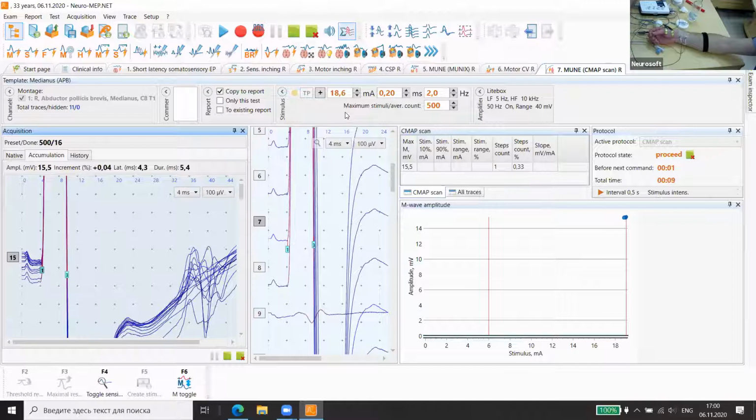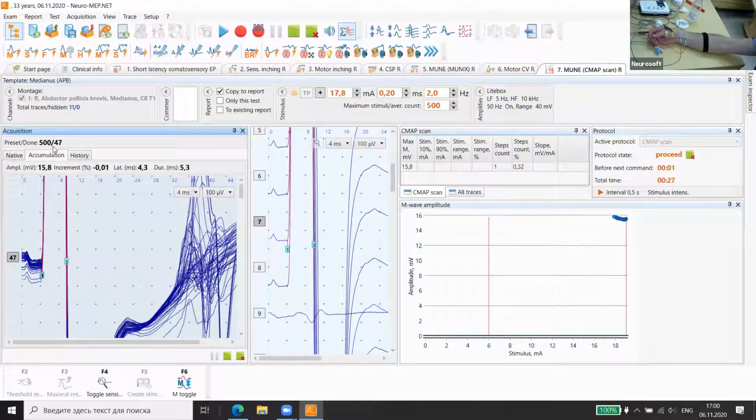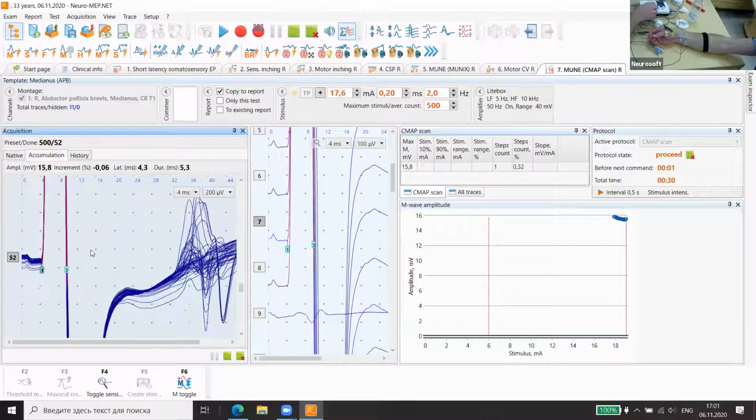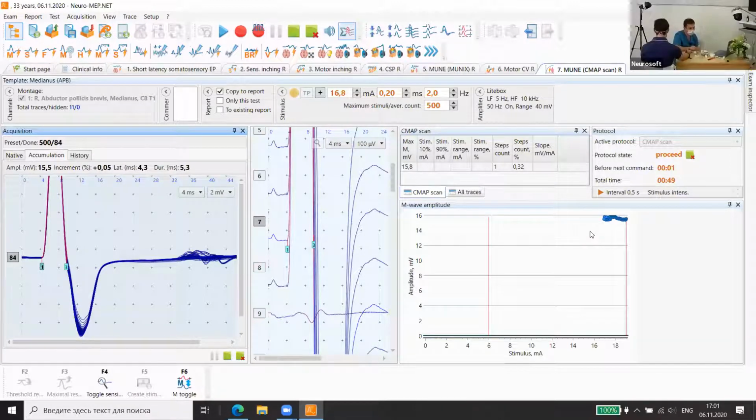You can see it's a gradual decreasing of intensity, up to the threshold level. You can see we will wait 500 times. A little incremental answer, but now it will be decreasing. It's not very comfortable for the patient, but not very painful.